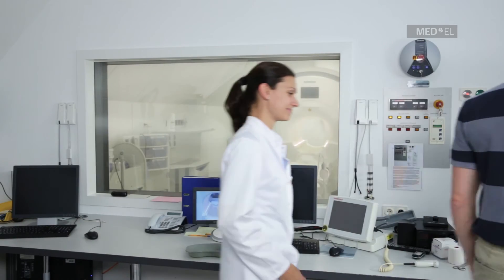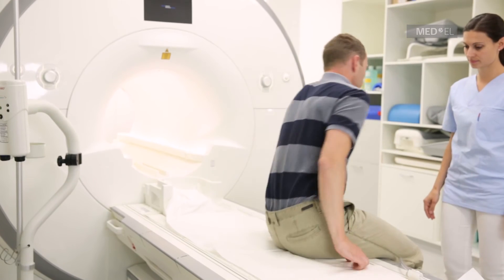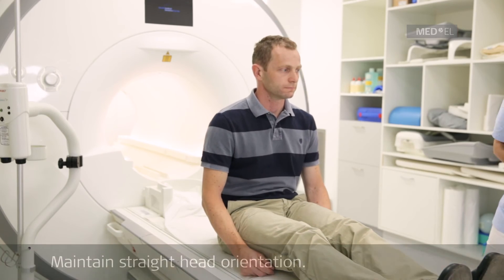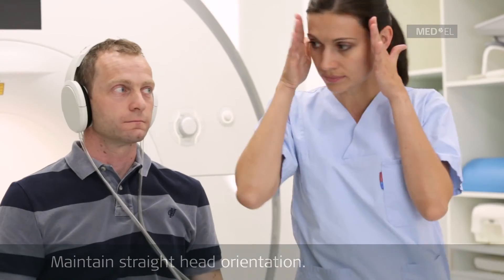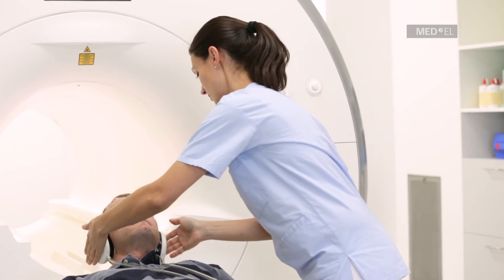Only closed bore scanners should be used. In the head and neck region, local transmit coils must not be used; however, local receiver coils can be used. Have the patient maintain a straight head orientation. An image artifact will be present in the implant area during MRI head scans.